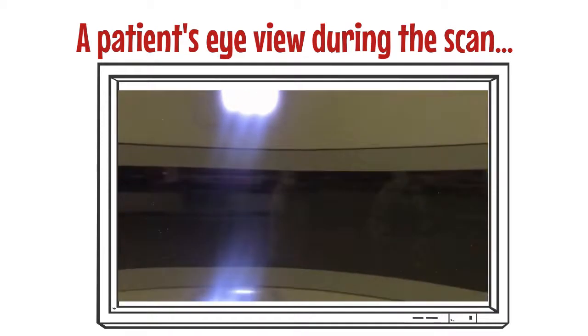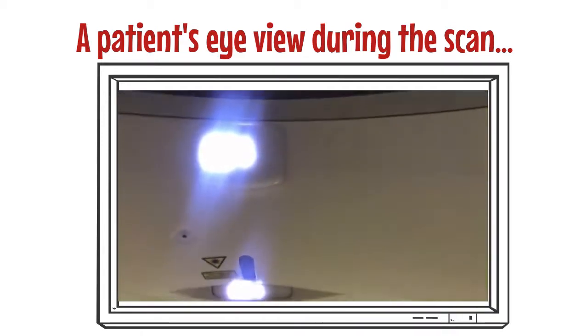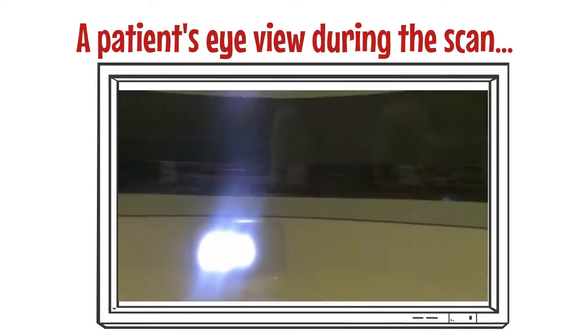You will need to stay still during your scan so that the images aren't blurred. There will usually be 1 or 2 short scans to ensure you are positioned correctly first, followed by a longer scan that will last around 20 seconds. You may also have more than one scan during your visit, but the radiographer will inform you of this beforehand if this is the case.